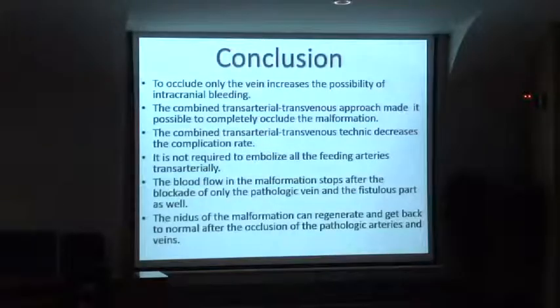And this woman 1 year later, and 2014. So conclusion, to occlude only the vein increases the possibility of intracranial bleeding.